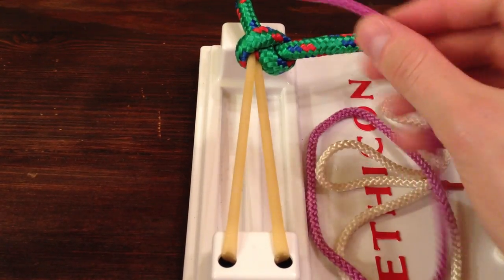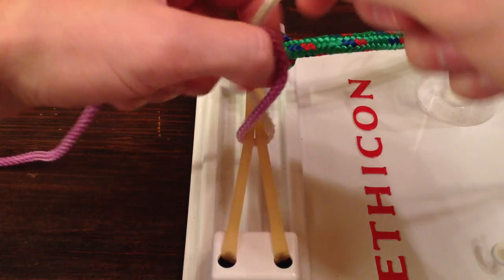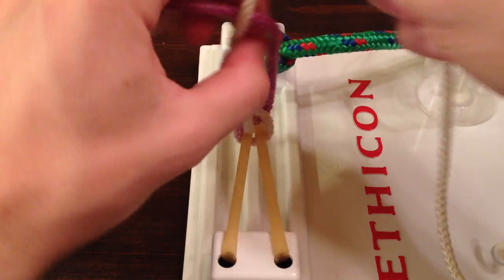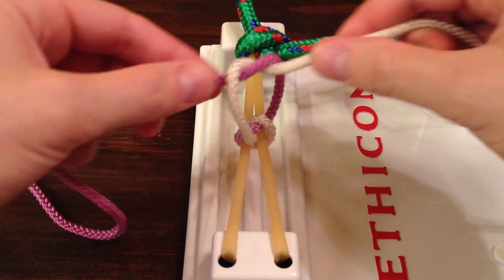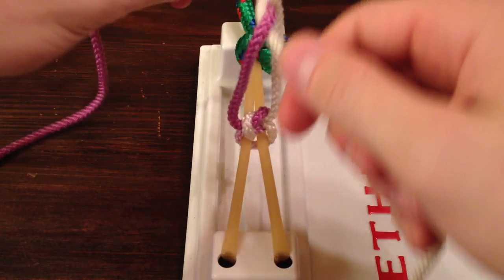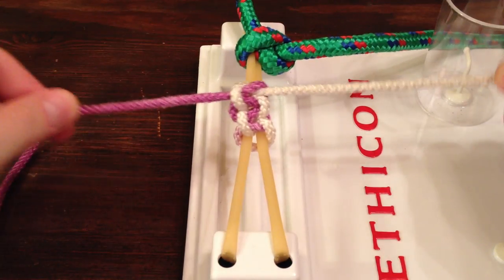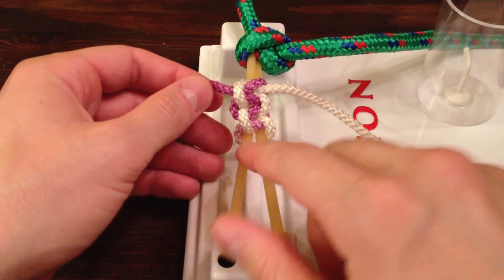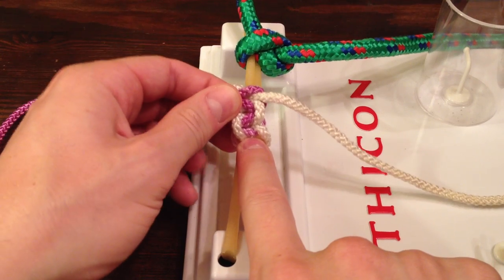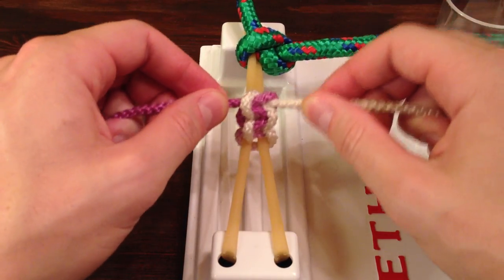First thing you want to do is take your suture and tie it to the skin. You can do this one-handed, two-handed — it doesn't matter, whatever you're more comfortable with. The important thing to know is that you don't want these to be super tight. In fact, this is the only time in surgery that I know of where bubble knots are okay. Three or four knots should do. Sometimes when you start, you can even leave a needle driver or any other instrument underneath the knots just to prevent you from cinching it down super tight on the skin.